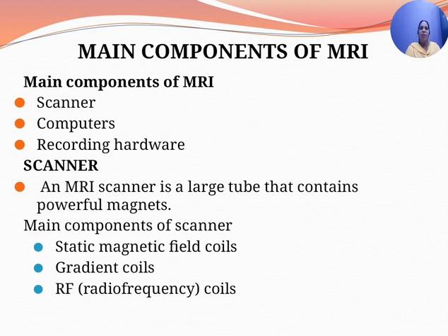The main component of the scanner is the static magnetic field coil. Then we have the gradient coils and the RF coils.